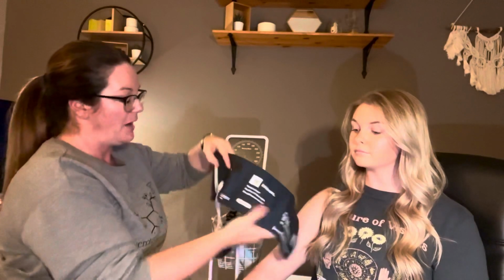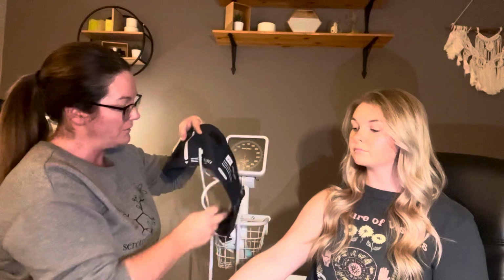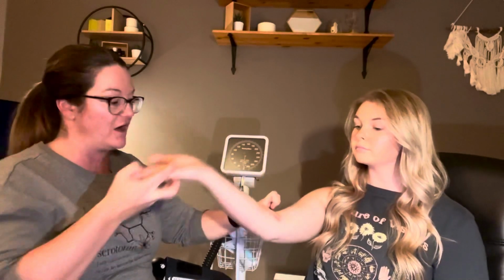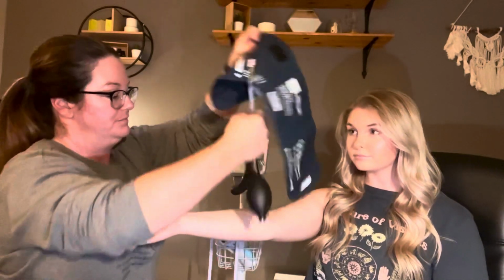All right, I wanna know which side goes out. So this side goes away from the patient's skin, and there's a nice little artery marker here. When we're doing blood pressure, we are using the brachial artery. So if you look at the patient's arm, it's gonna be on the pinky side, and it's gonna be just above this antecubital fossa, okay? That's where I want the artery marker to go.